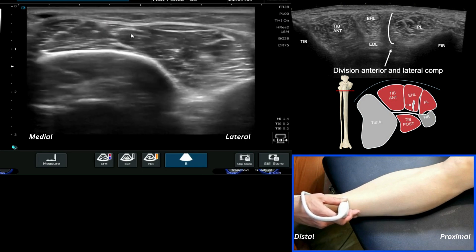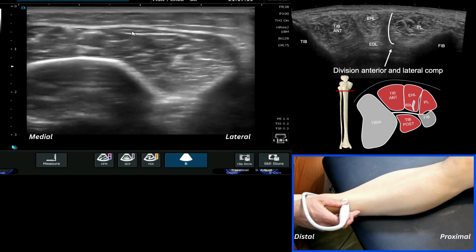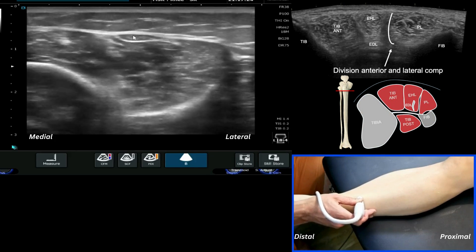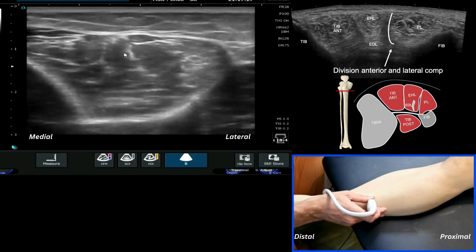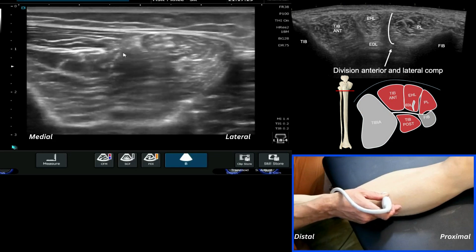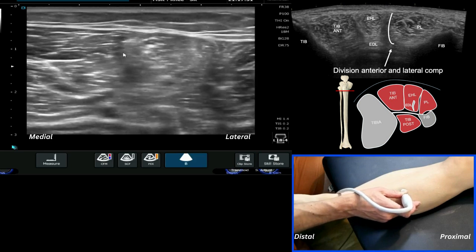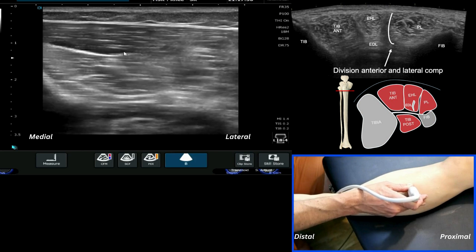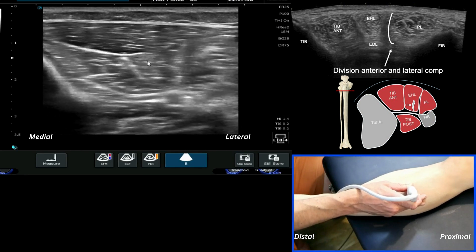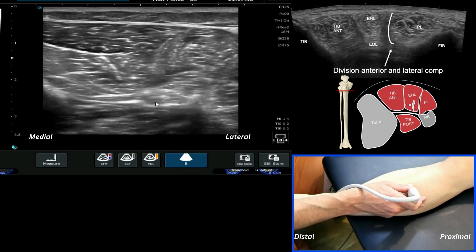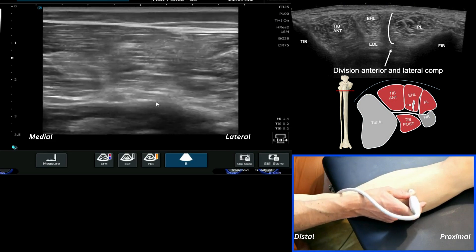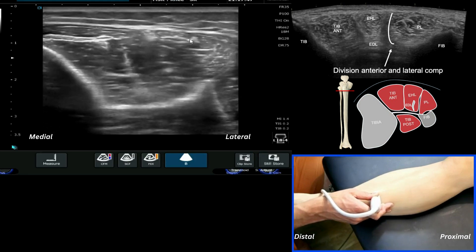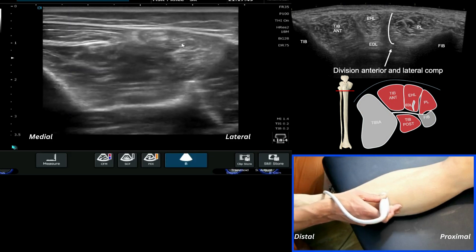Continuing up, we start to see the extensor digitorum, which sits slightly more lateral. This is the digitorum tendon starting to thin out, and this is EHL. As we come up we start to see the more clear musculature of this region: the large tibialis anterior, with the anterior tibial artery still sitting deep, and then the EHL and extensor digitorum.